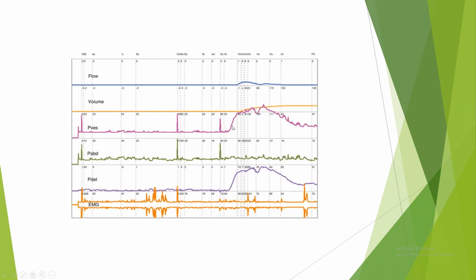So now again this graph. See whether this graph is complete or not. Both parts are given here, filling as well as voiding. Yes, this is complete. Second thing, it has started with zeroing.